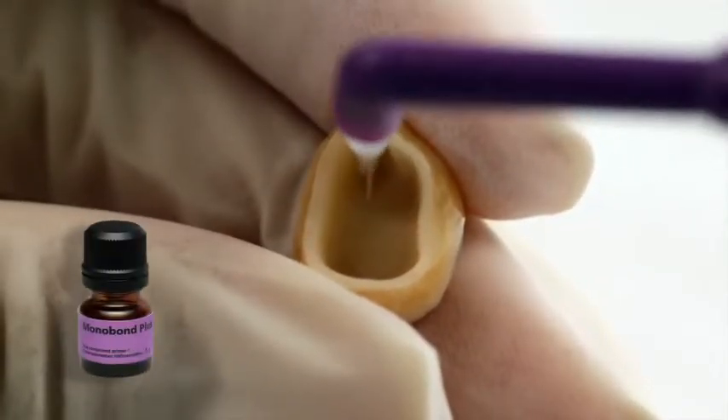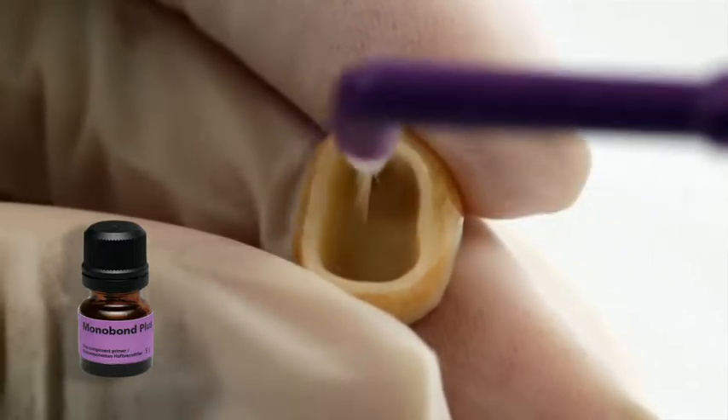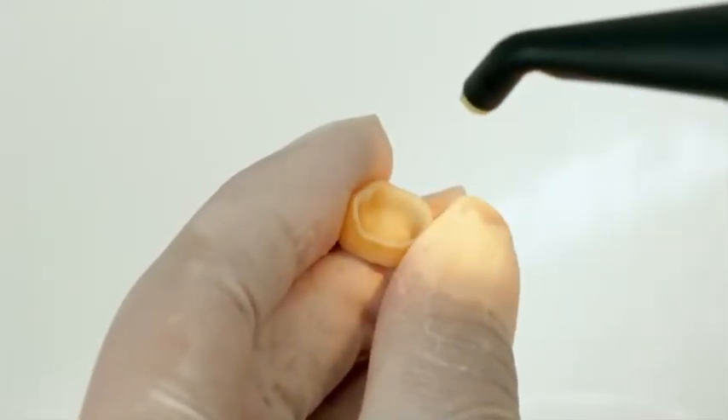Apply the Monobond Plus bonding agent to the pre-treated surfaces with a brush or microbrush and leave it to react for 60 seconds. Subsequently, disperse excess material with a strong stream of air.